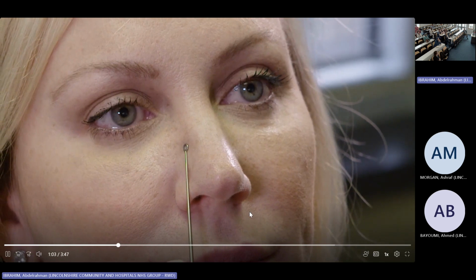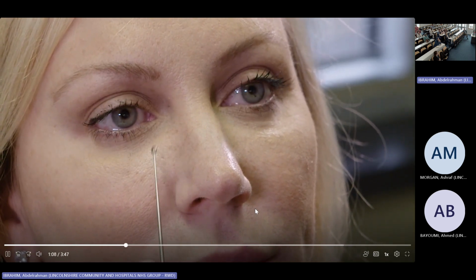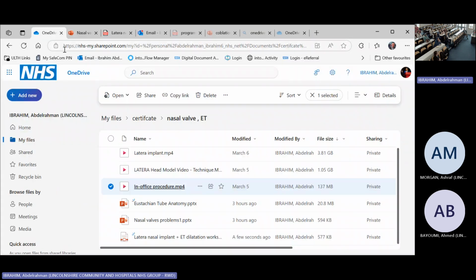So what we're going to do today is basically insert Latera, which is going to go in here in a subcutaneous layer deep over the bone to about this point. And what that's going to do is cantilever off the bone and basically create support to the sidewall and improve her breathing. So I can go ahead and I can place.